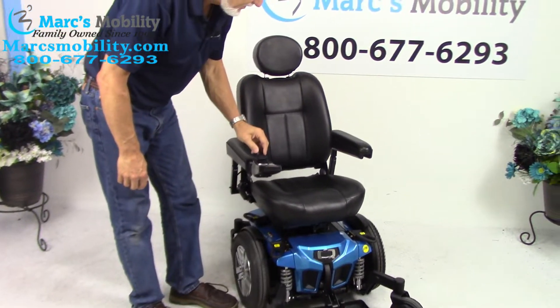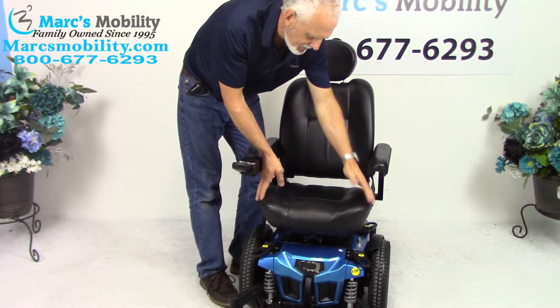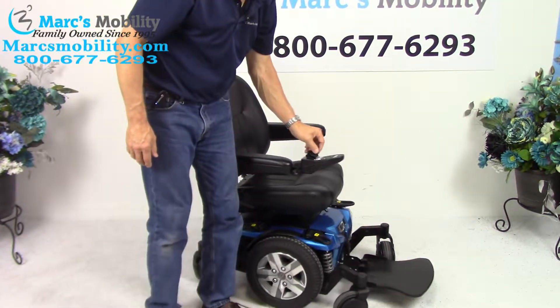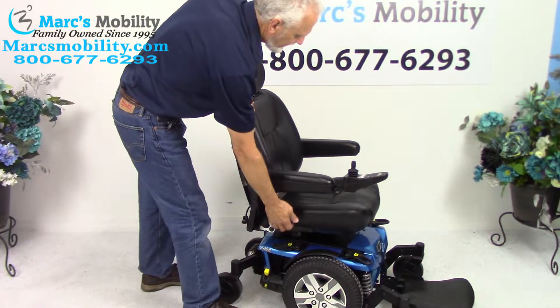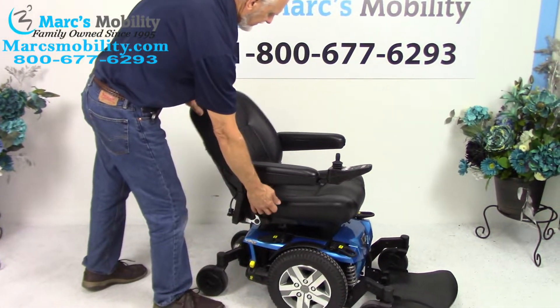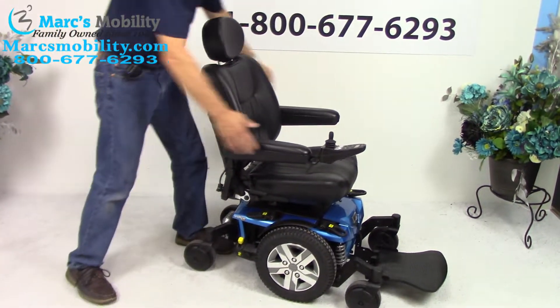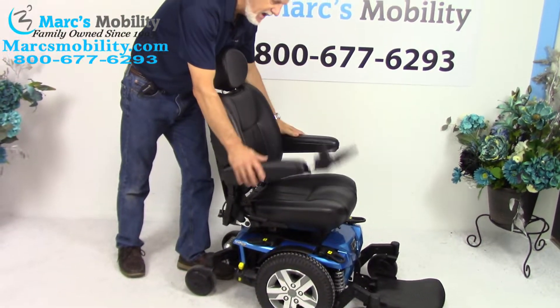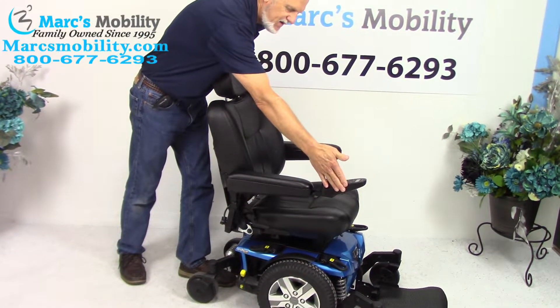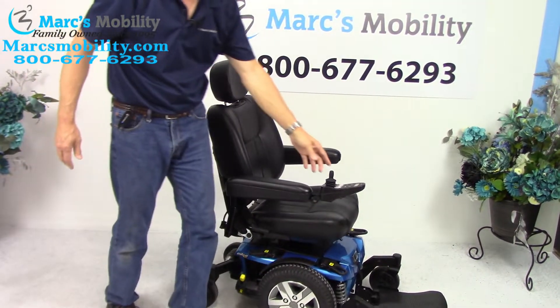The seat on this chair is 18 by 16 — this is a captain seat, which means it's adjustable. We can fold it down or go all the way up, or you can leave it in driving position. The arms flip up and can also go out if you need more width — they come out from the back. The joystick is on the right, but if you're left-handed, we can switch everything to the left side with no problem.